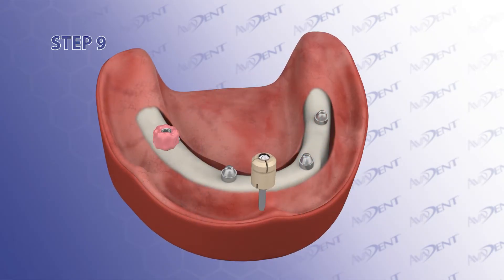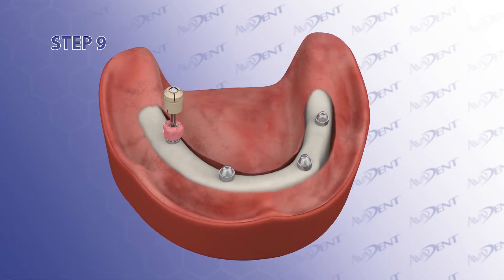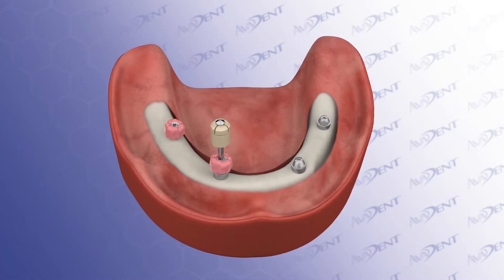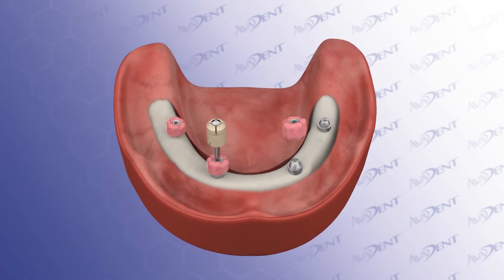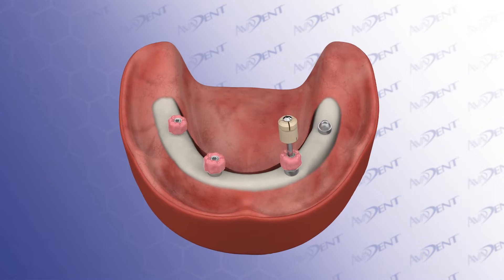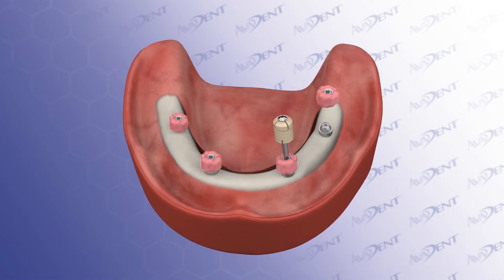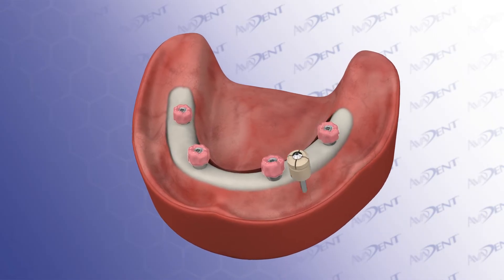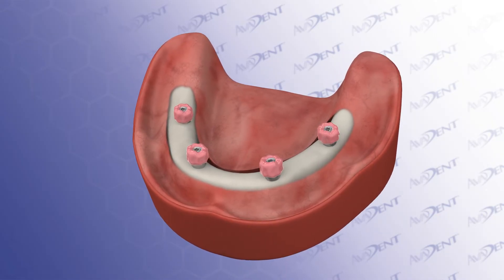Step 9. Using the ultra-low torque driver, place the pre-coated tie bases onto the multi-unit abutments. The ultra-low torque driver prevents unintentional separation of the head of the separable fastener from the threads of the separable fastener. It's good technique to feel with your fingers that the tie bases are secured sufficiently to the abutments before picking them up in the denture.